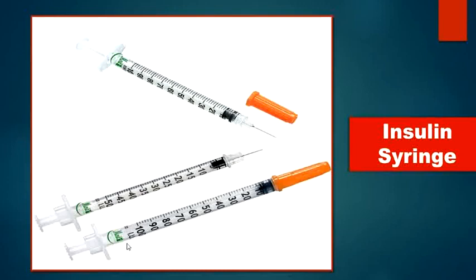Another commonly used indication is diagnostic: tuberculin skin test, or purified protein derivative, also using the insulin syringe.